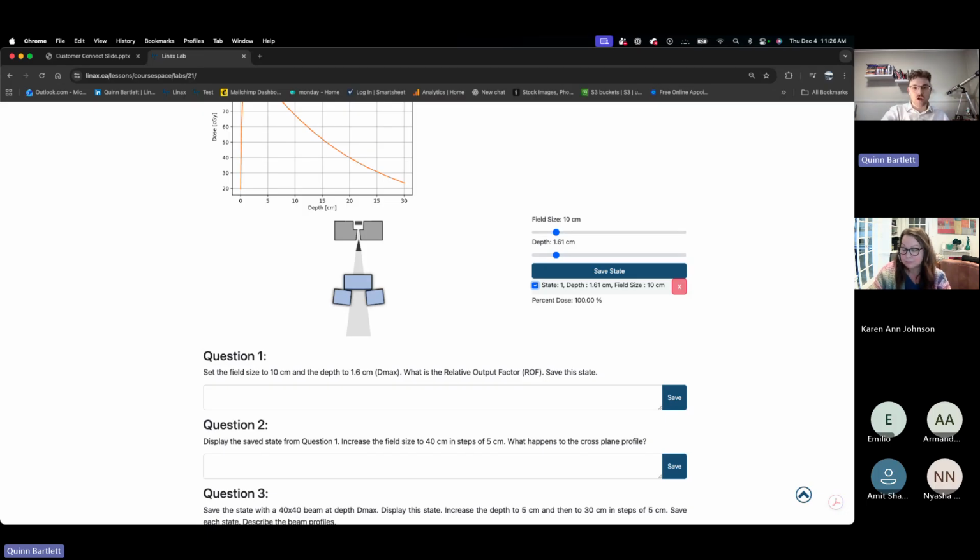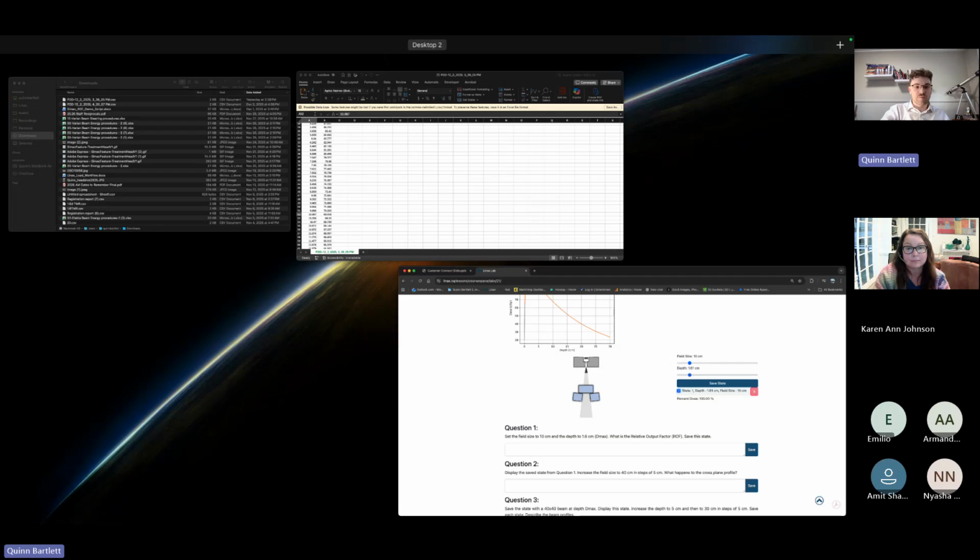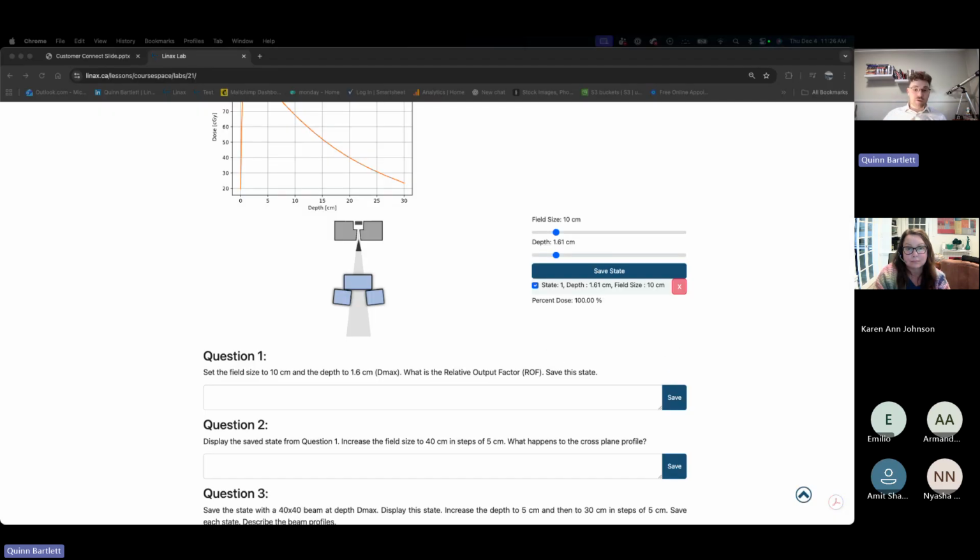So this is really what we're trying to provide for people, and we really believe that Simac can make people's day-to-day Linac jobs easier. Just being able to investigate beams before you go into the machine, just being able to research some different configurations that you're looking at, and you can do it at any time and on any device.